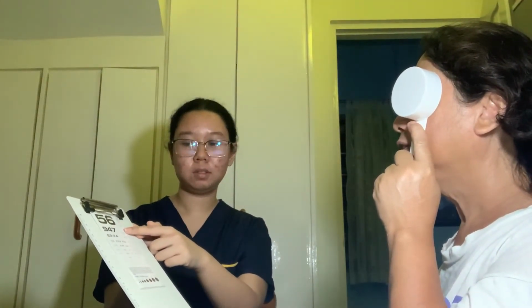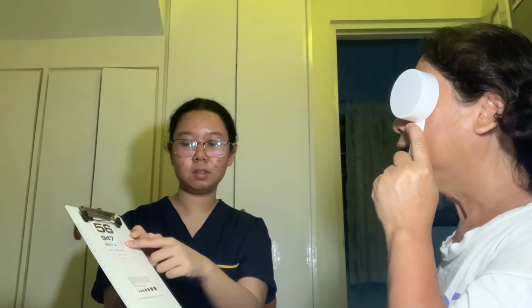Test one eye at a time by covering the other. Hold the Jaeger chart around 14 inches away from the patient. First, test the patient's vision without correction lenses.